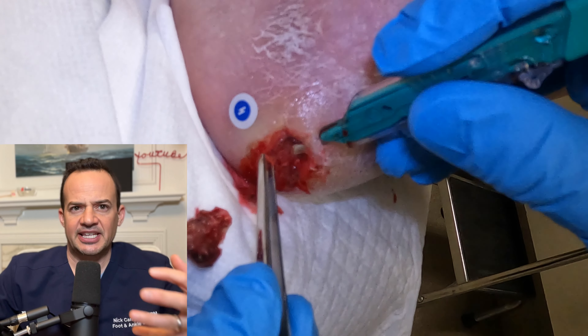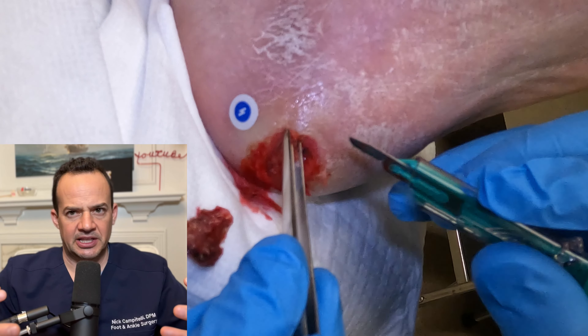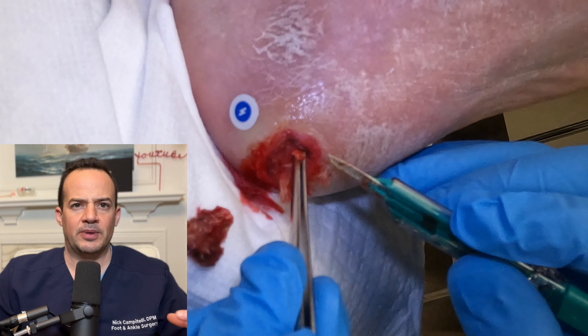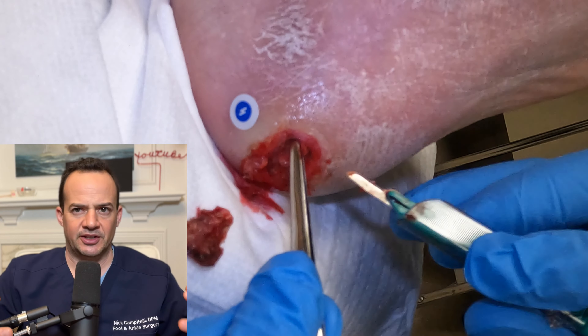When those skin edges you can see me removing are like a cliff, it's very hard for those skin cells to migrate across the wound bed to form healthy epithelial, or skin, tissue.